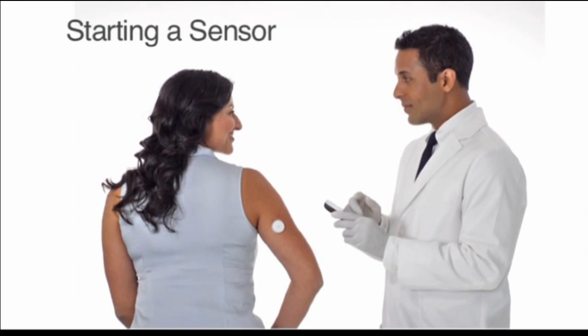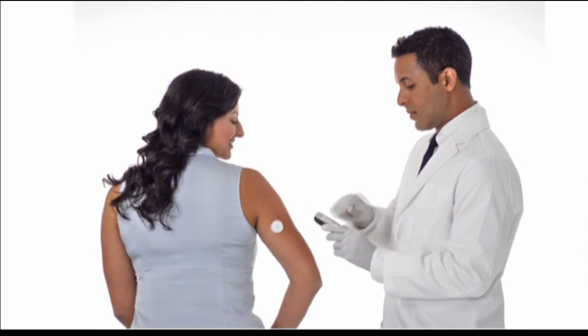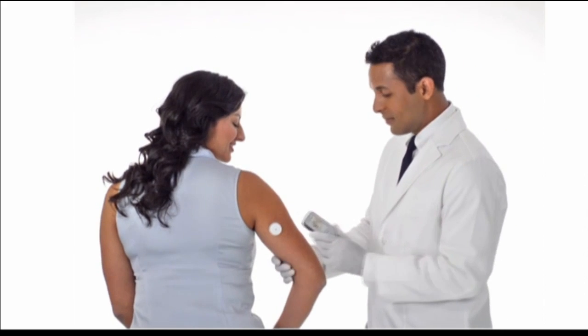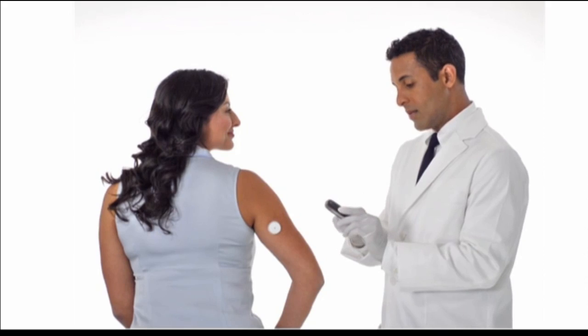Starting a sensor: press the home button to turn on the reader, then touch 'Start New Sensor.' Hold the reader within 4 centimeters of the sensor to start it.